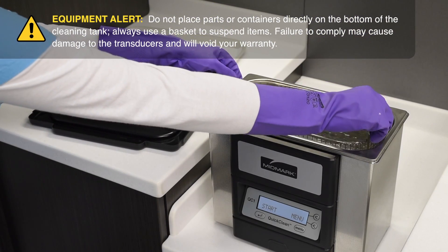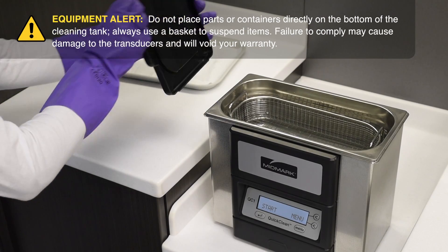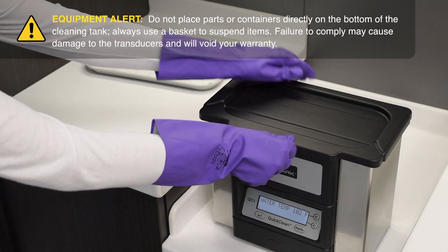Place the items to be cleaned in the basket and insert the basket into the tank. Place the lid on the unit and press the start key to begin the cleaning cycle.